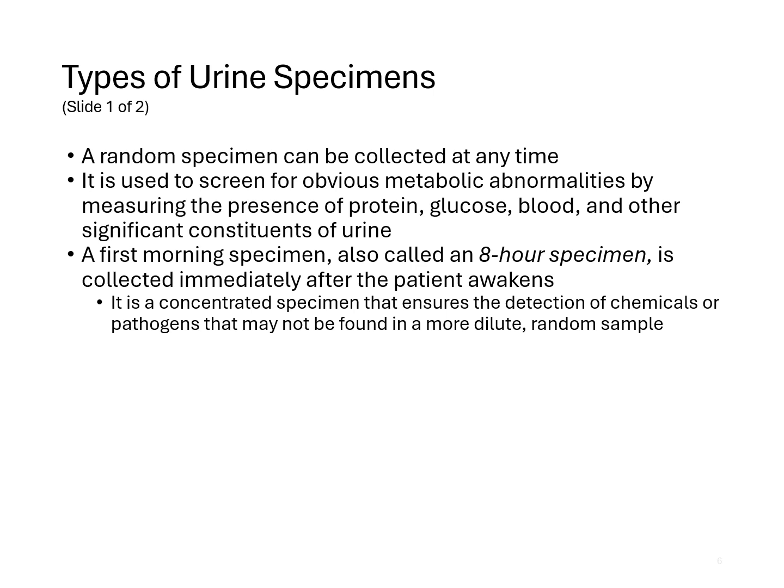First morning specimen is exactly what it says. It's the first urine that somebody will void that day. It's also called an 8-hour specimen. It is collected immediately after the patient awakens.